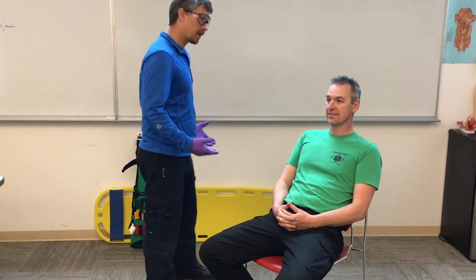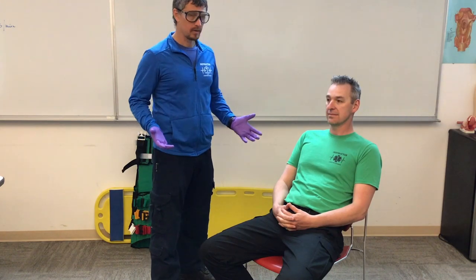Welcome back. Today we're going to talk about the KED — the Kendrick Extraction Device, or short backboard. First off, I'm going to make sure I have my proper PPE on: my glasses and my gloves.